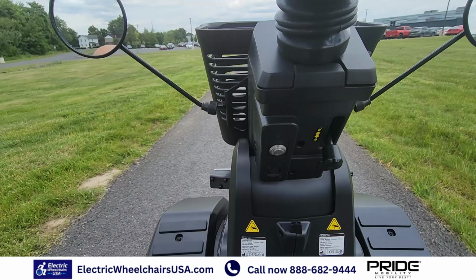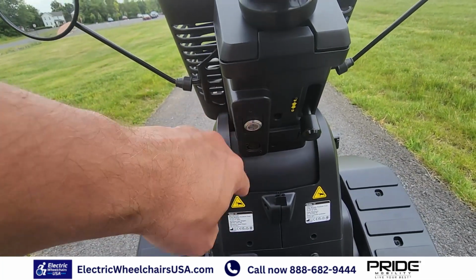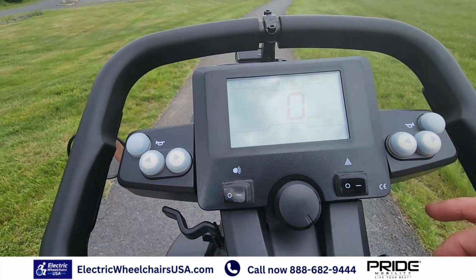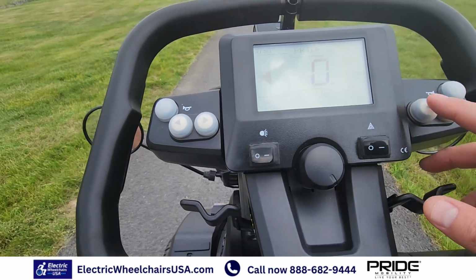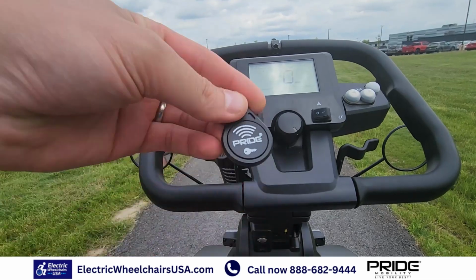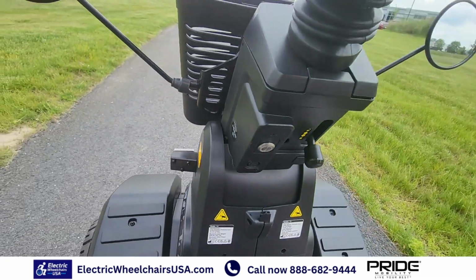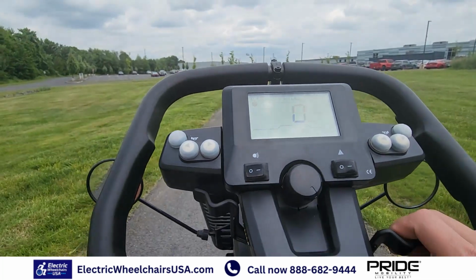So the unique thing about the scooter, this is how you turn it on. You press this button, turn it on. The charging port's also right here. So I can turn it on and you'll see the dash actually lights up. So it looks like you can use the scooter, but you can't. You can't accelerate. You can turn on the lights and horn, but you're not going to be able to actually drive the scooter. And that's because you still need the key. So there's a key fob that you press against here, and it makes a noise. I don't know if you could hear that, but it's a really faint noise, but now you can actually use the scooter.